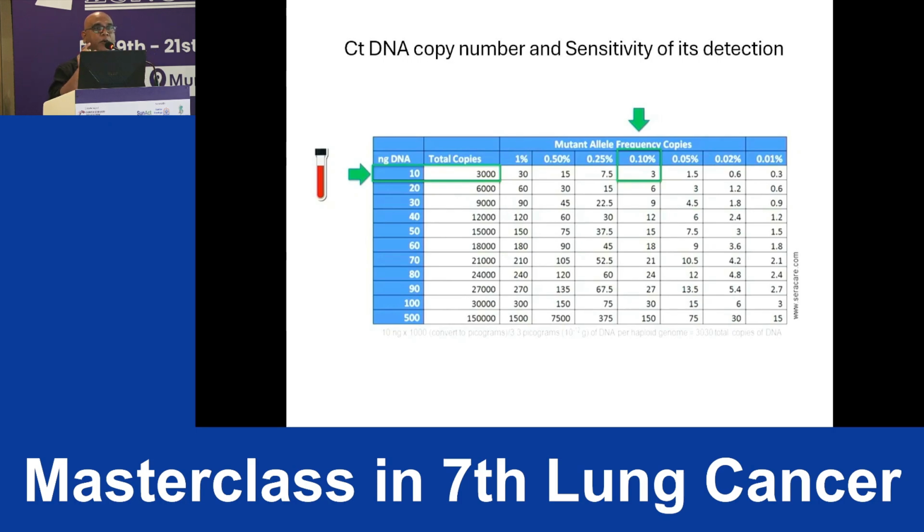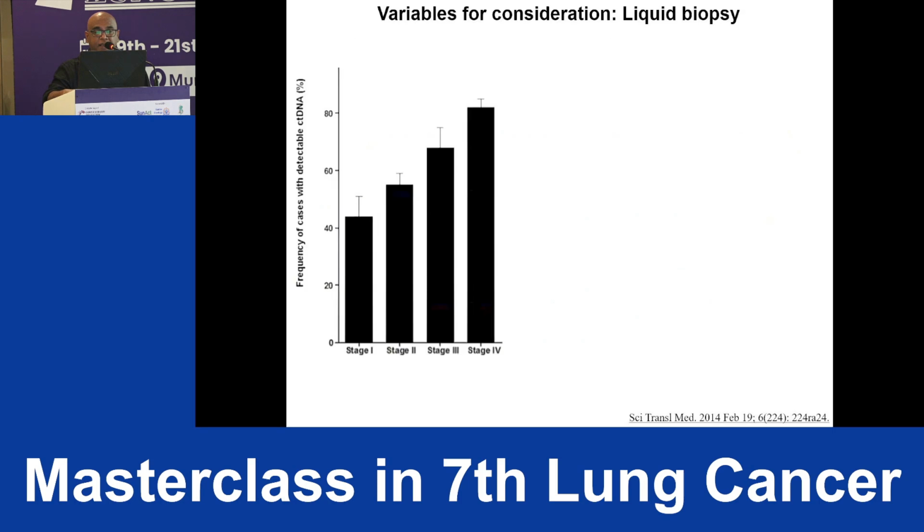So anything in that range, depending on the limit of detection of the service provider, if the allele fraction is below 0.1% and at least 3 reads have not been read, again creates a sense of doubt. These were the technical aspects of the liquid biopsy. I'm just giving you a bird's eye view, but I will be happy to talk in detail should there be any interest.